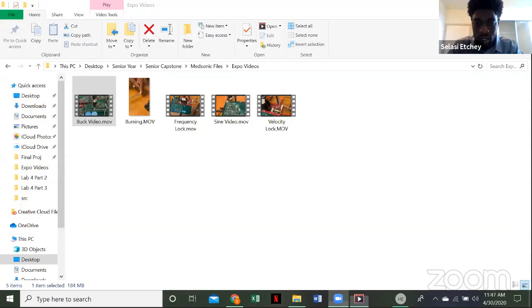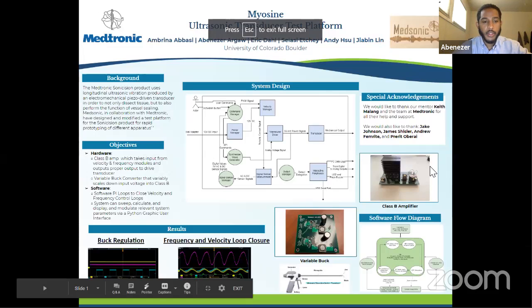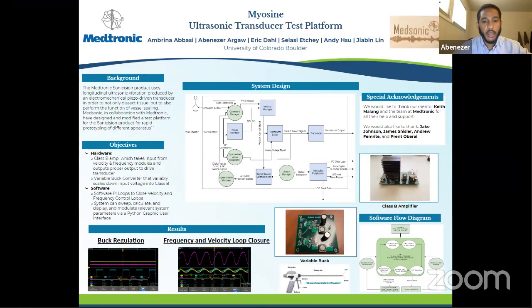Okay. Cool. So another point for our velocity manager will be our sine amplitude that is fed into the Class B amplifier, and we are able to vary our amplitude in 2 different modes of operation. So in open loop operation, the sine amplitude is varied with our user inputs, and we can scale that up or down using the GUI and specific buttons, and we'll show that in our demo as well.